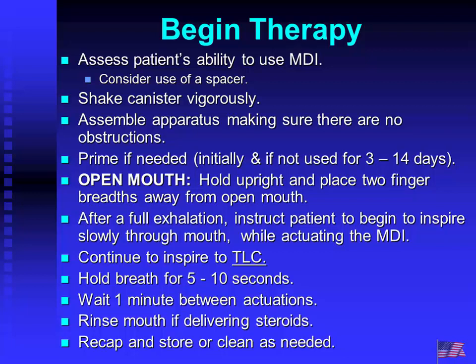Just reading a study that was released in Chest. It was talking about something like 70% of patients who are using MDIs are missing at least one of those steps, and about 40% were missing 3 steps. One of the biggest was the shaking of the canister, patients not knowing that.